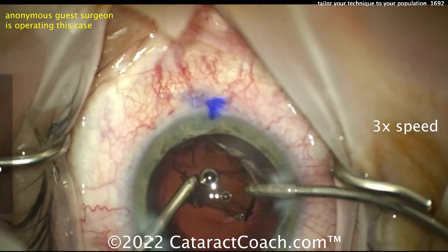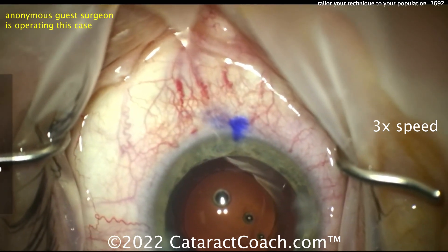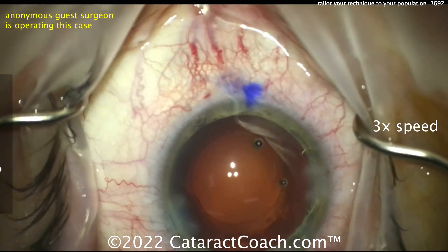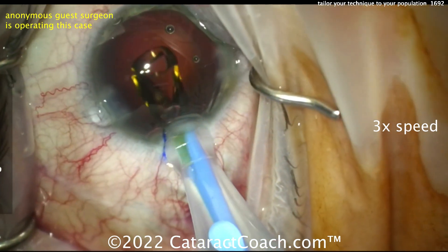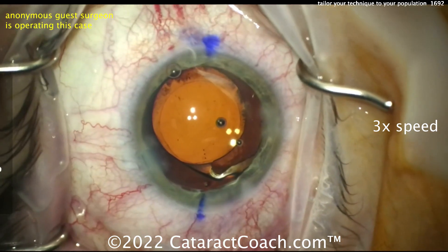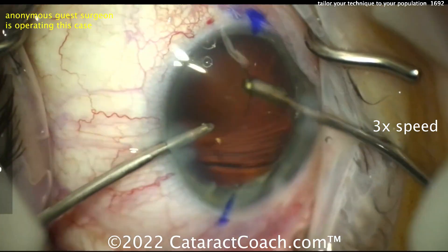I really have to emphasize that because it's a very important point. Here in Los Angeles, you can have multiple different populations. When I taught residents for 22 years at the county hospital, brunescent and dense white cataracts were the name of the game. In a day of 10 cataracts, at least half needed trypan blue dye. Contrast that to my Beverly Hills population — patients don't have such bad disease because they present much earlier in the cataract spectrum. I use trypan blue dye in Beverly Hills less than 10% of the time, versus 50% at the county hospital. Be like this Australian surgeon — beautiful technique, appropriate for your patient population.